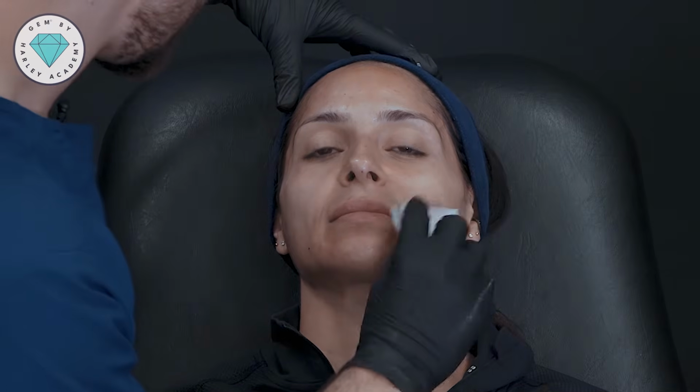Let's take a look now at this entire half of the face with the other side untreated. I'm going to see forwards, looking into the camera. Beautiful. All right, so let's take a look at this side, untreated, and this side, treated. And I'm going to treat this entire side now, and then we'll see the full after results.